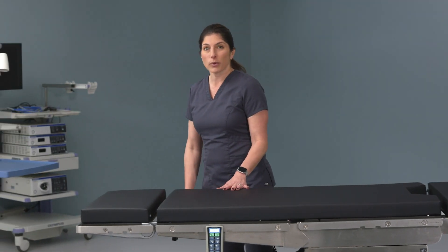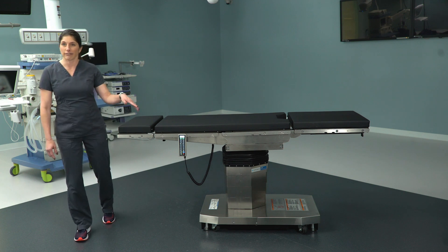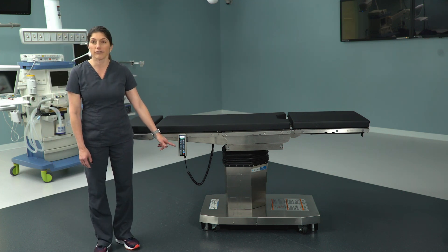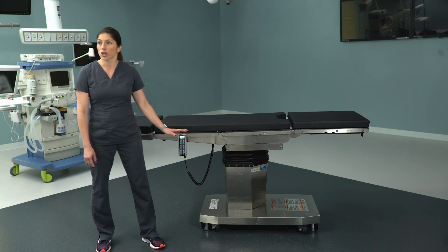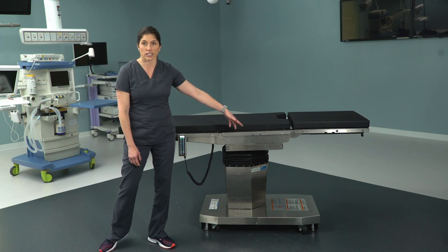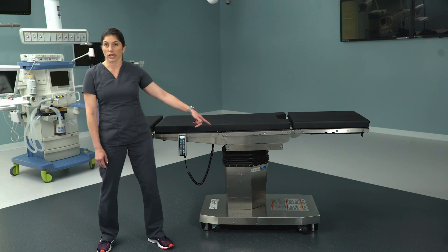One of the things I want to point out first and foremost — that I'm sure you've already noticed — is the base configuration. You'll notice right off that the base is configured differently than it is on the 3085. On the 3085, the long end of the base is up near anesthesia and the short end is at the foot. On the 5085, the short end is near anesthesia and the long end is at the foot.